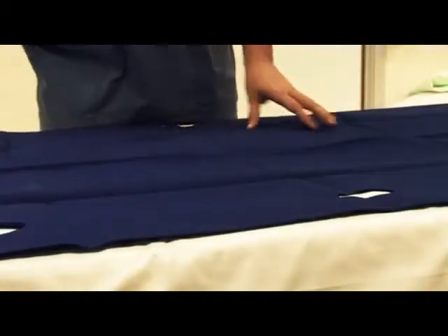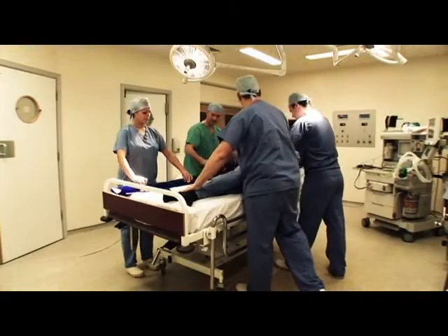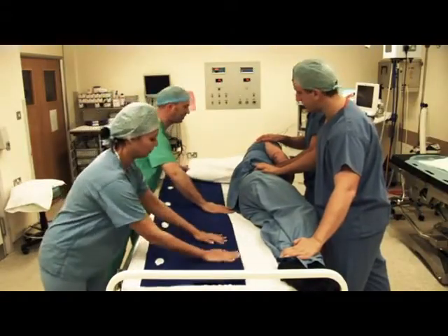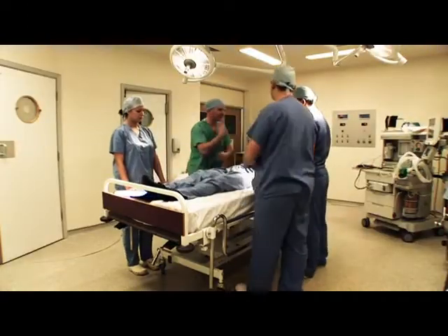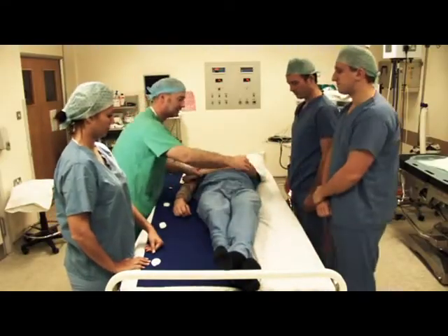There are two separate sides to the sheet. The smooth, shiny side should always go face down on the trolley or operating table. For circumstances where the patient is already supine, there is a simple log-roll technique for inserting the FlexiSlide, which will prevent excessive moving and handling. Unfold the FlexiSlide along the bed, keeping the handles facing towards you — this should ensure the correct side of the sheet is used.